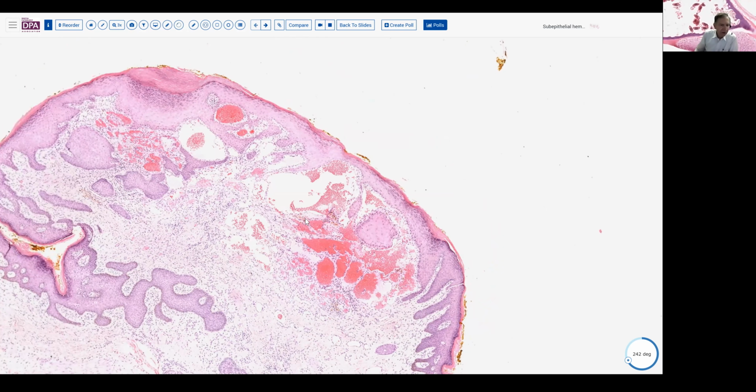This is a very characteristic lesion that is located most frequently on the scrotum or on the vulva. In some situations with other symptoms, it may also be associated with internal anomalies, such as can be seen in Fabry's disease, patients who may develop other findings in the GI tract. It is relatively unusual and has no other particular clinical significance, other than that because they're so superficial, these may occasionally be damaged and bleed and create a little bit of distress for the patient.